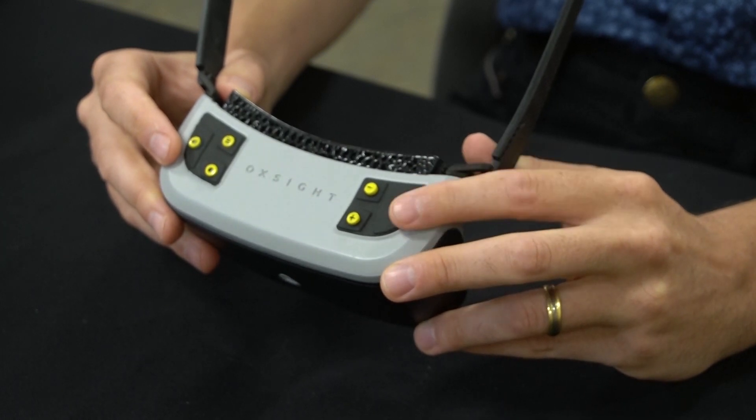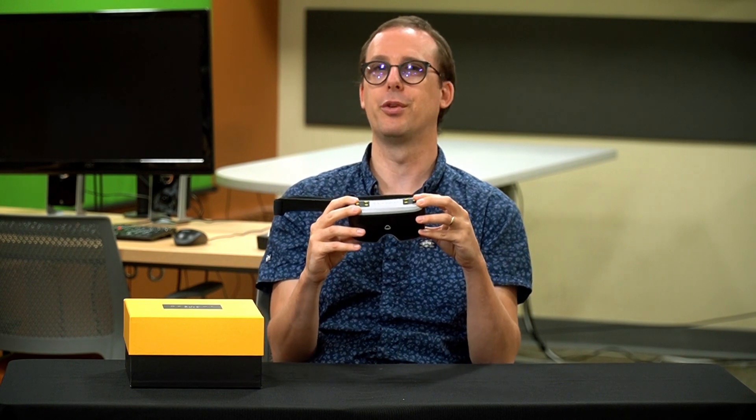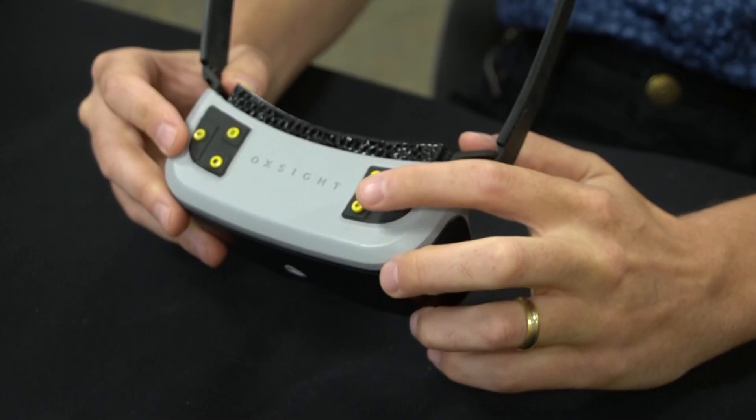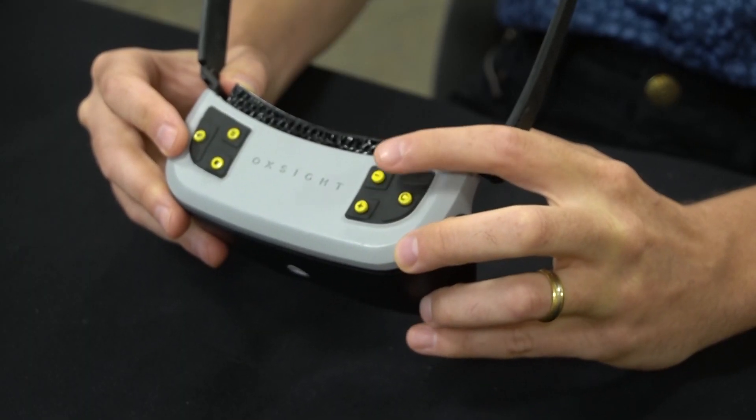From the far left, we have the power button — I'll let you guess what that one does. Next, we have the magnification controls: plus to zoom in and minus to zoom out. No surprises there.